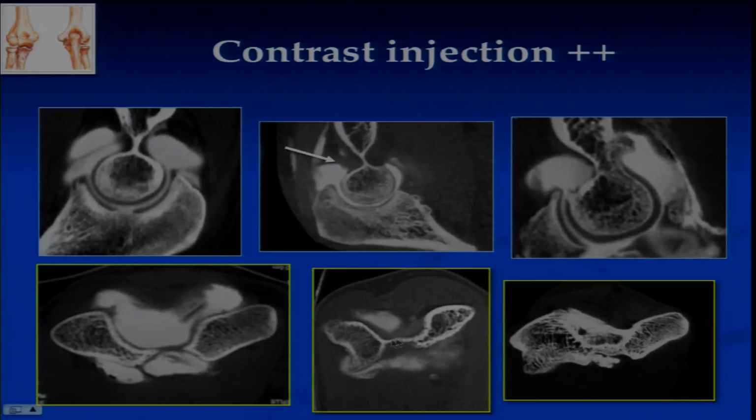So you can expect from a simple resection with a shaver an improvement of the mobility. And of course, when you have some long delay between the trauma and the operation, you can have a full filling of bone with spurs on the sagittal imaging and on the horizontal imaging. And of course, in this case, you have to resect a lot of bone, and you can do it arthroscopically.